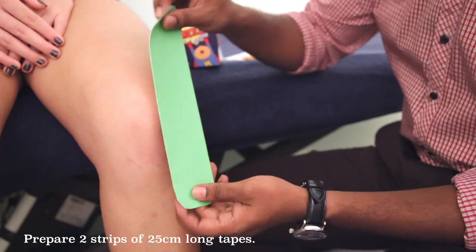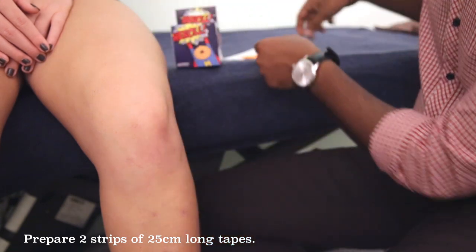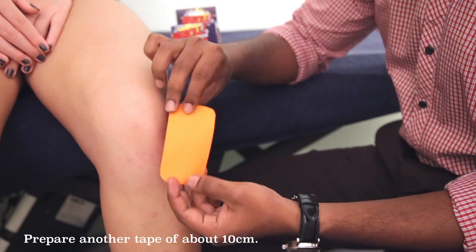For this method, we will be using two strips of 25cm tape — one, two — and one last tape which is about 10cm long.